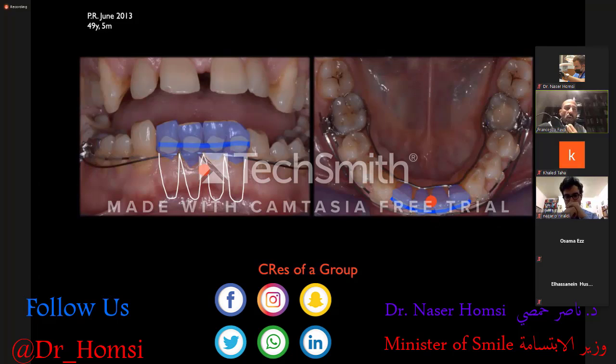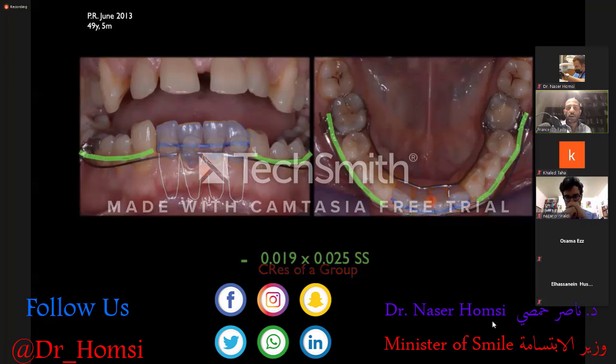So we are now discharging the intrusion forces on a block of teeth consisting of all four incisors soundly connected together.